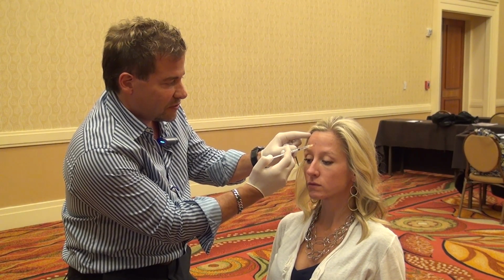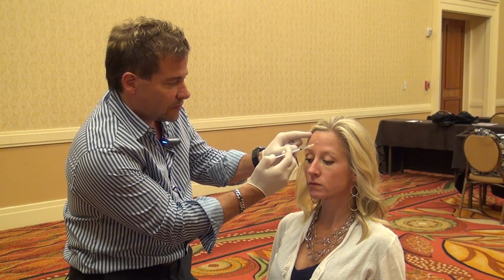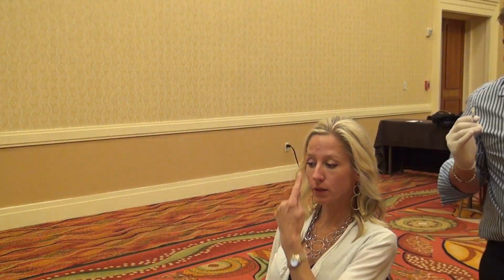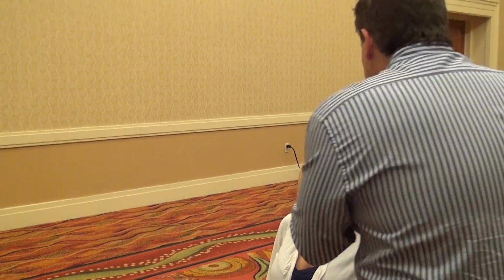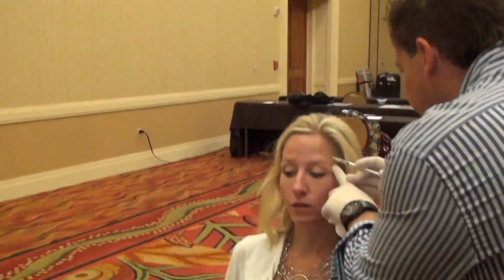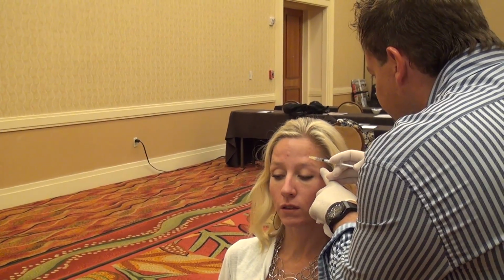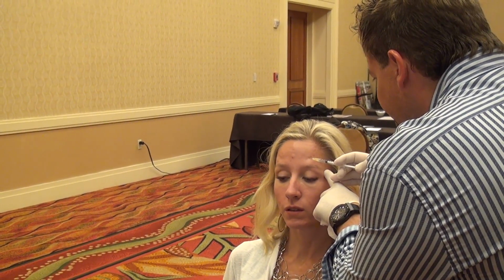Everybody see that okay? Good. Could you add a little bit more in front of? A little bit? Do you want me to, you said? No. Okay, so here we have 2 units here. There we go, and 2 units there.